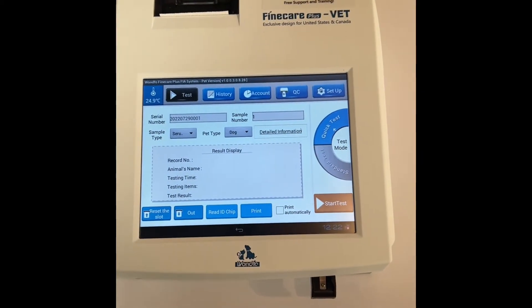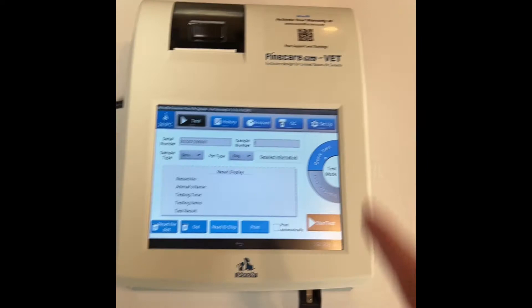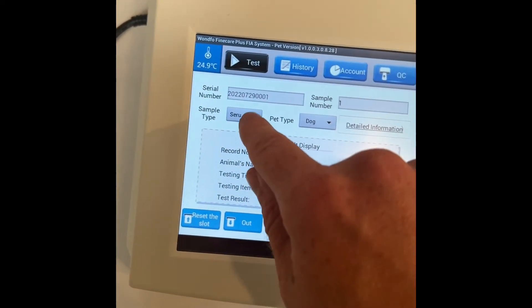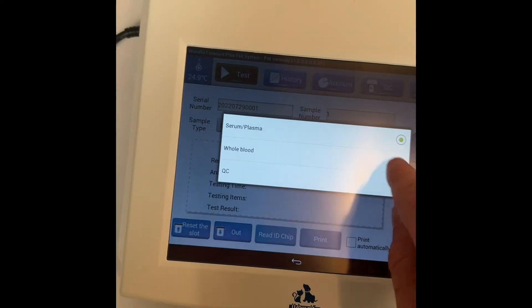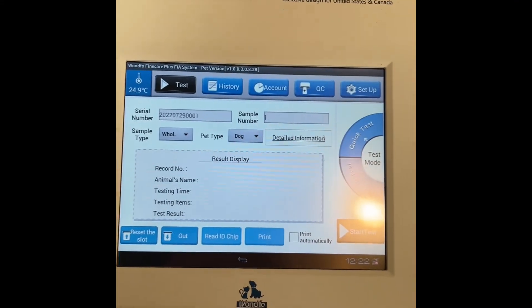Running a test with the whole blood kit is exactly the same as any other test, except you want to make sure you go into sample type and select whole blood. That's going to make sure the machine has the right calibration for the whole blood test.